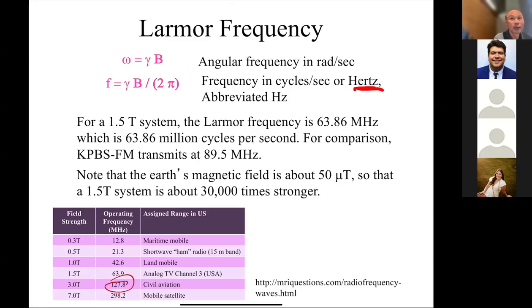What am I doing? We're looking at the Larmor frequency. Basically, essentially, the rate of precession of the spins. So that's the Larmor frequency. No, for proton. Yeah, that's right. This is for proton. So you could just put that number in.